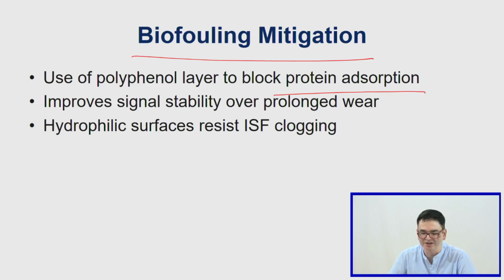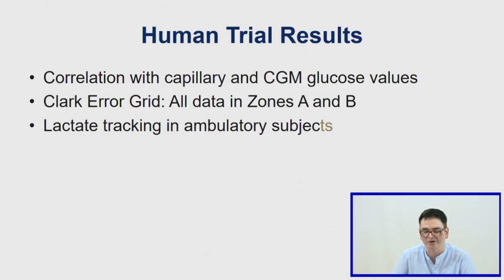The biofouling, you can also improve this. Polyphenol also improves the signal stability over prolonged wear, and it's a hydrophilic surface which is also resistant to interstitial fluid clogging as well. That's how polyphenol layers help in mitigation of biofouling.